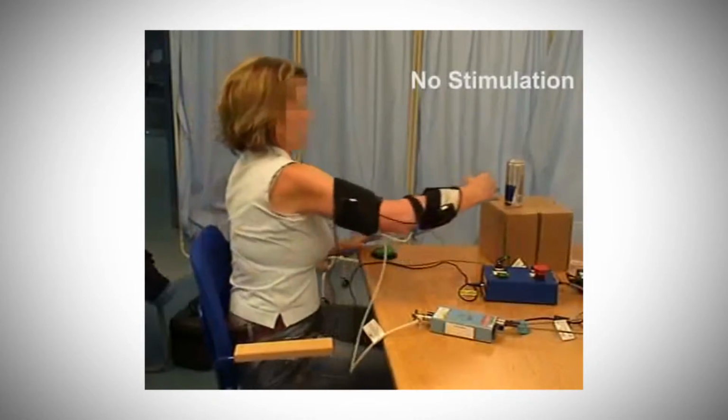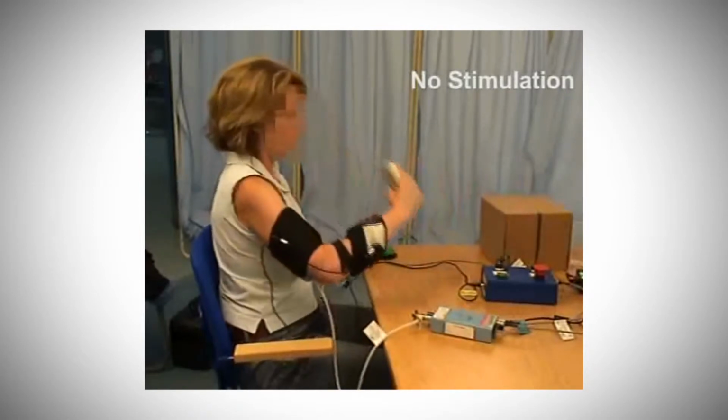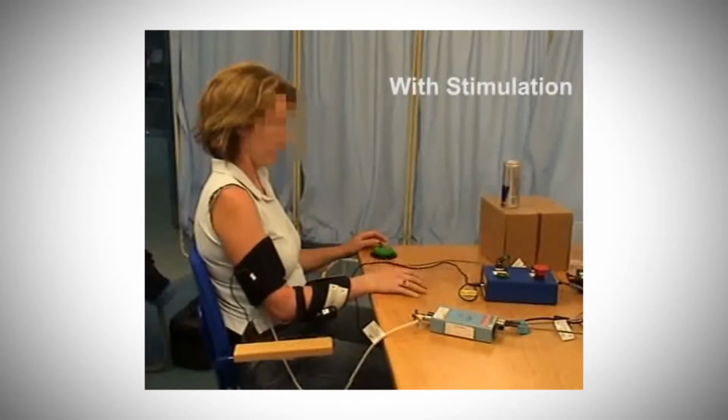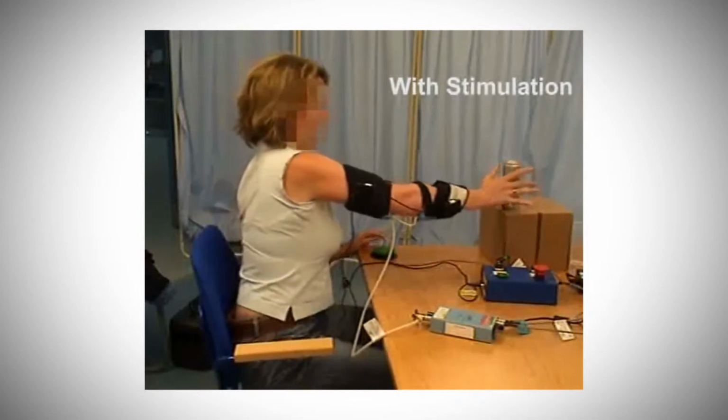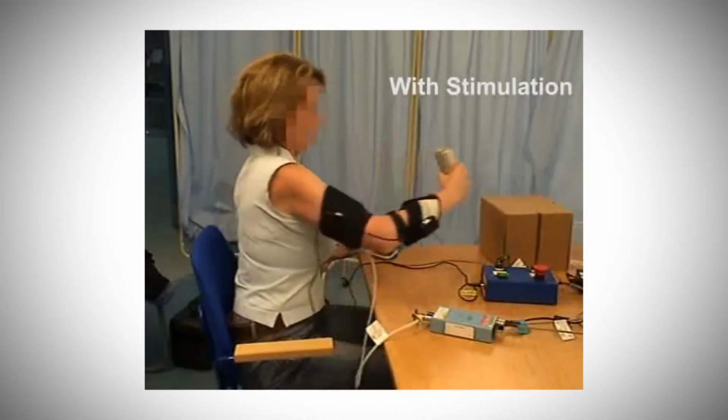And so we did a study with them, which took 4 years, and we developed a way of controlling the stimulator so that we could activate different muscles at different times. And we had 7 patients who we did this with, and we stimulated the muscles to open the hand, and the muscles to extend the elbow, and the muscles to lift the arm. And we showed that if we did that, we could actually get quite a lot of improvement in their ability to move their arm. And the idea behind it was that they would relearn those movements. So they would relearn to be able to use their hand. And this was shown to work quite well.